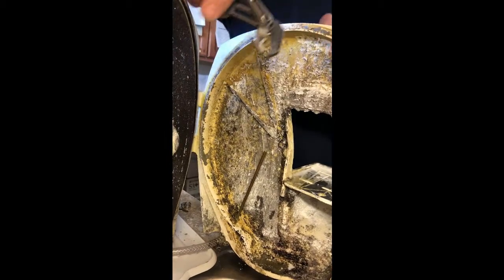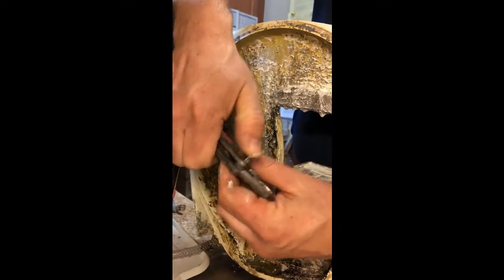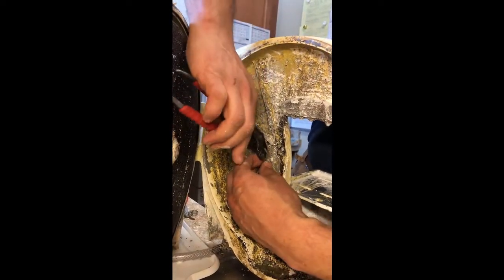Now we've got to take extra care not to break the tube, but all we're going to do is grab onto there and then move these a little bit closer together. These pliers, we'll try right out here at the end. So we'll just pinch that. And actually, they do seem to have an extra little spot in here that maybe we'll try to leverage, that little honey spot right there. Just kind of kink it. So we'll go right there, and then we'll really carefully pinch that, and that's gonna kink that off, like so. We'll just pinch it a couple times.